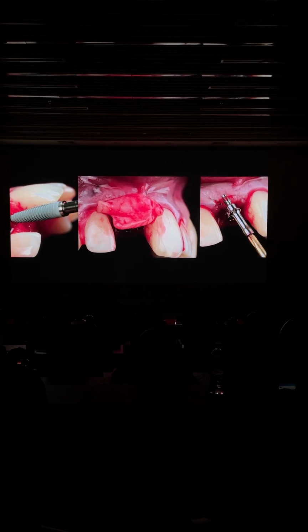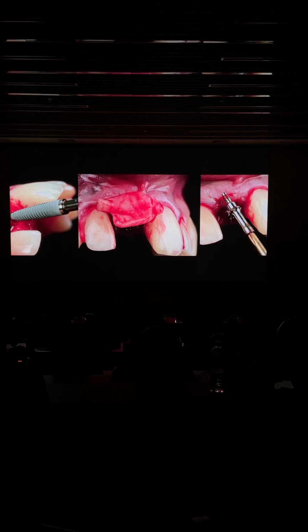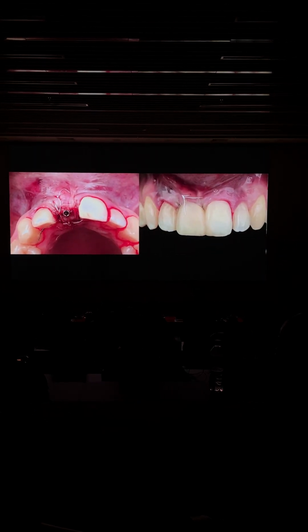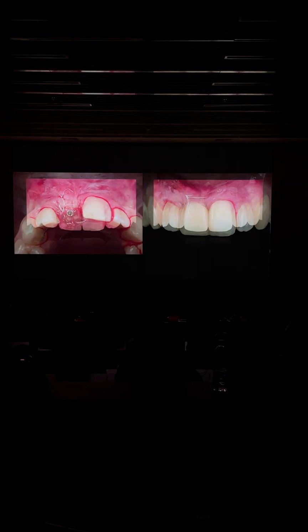And then I do these extensions when I have short papillas. And we only grafted crestally. Okay? So we don't go above if there is a thin biotype, phenotype, like in this case, we just grafted crestally and on the adjacent teeth in order to control the papilla volume.